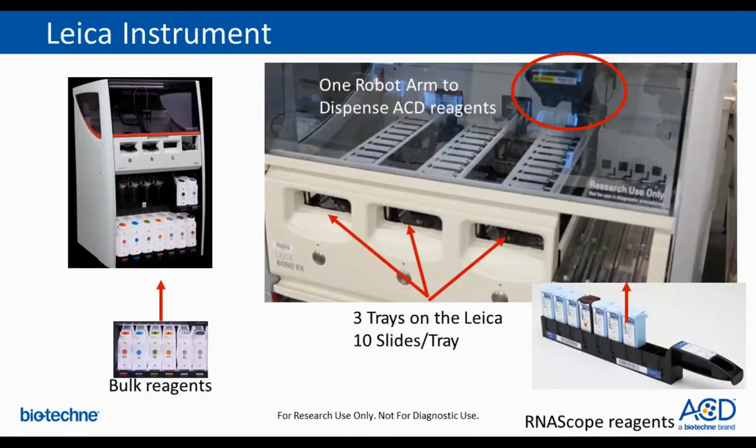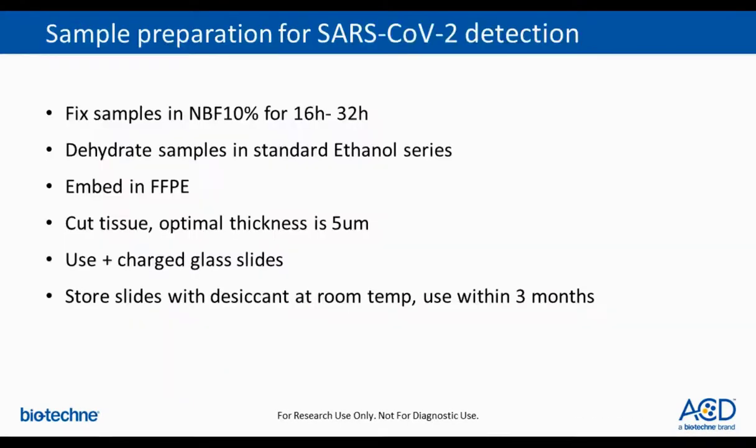And at the end of the day, as I said, it's an overnight run, you're going to have your slides completely stained. All you need to do is just coverslip them.